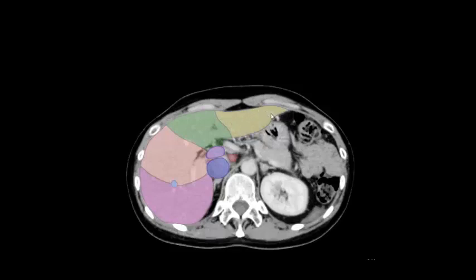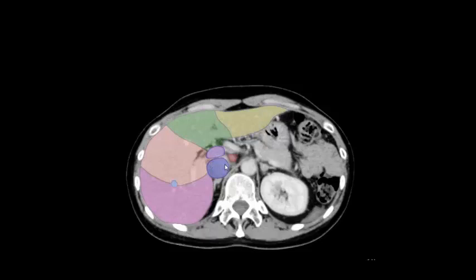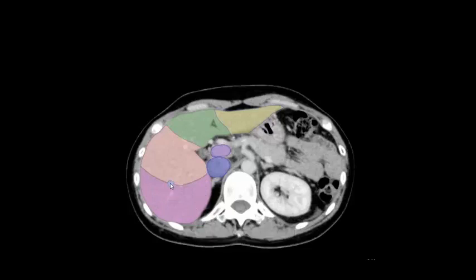Segment 3, segment 4b, liver segment 5, liver segment 6, right hepatic vein, portal vein, IVC, inferior vena cava, caudate lobe segment 1.